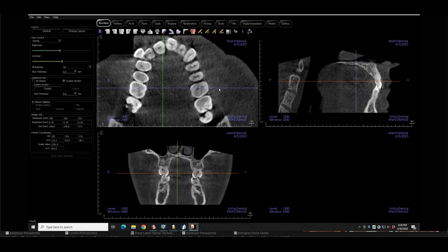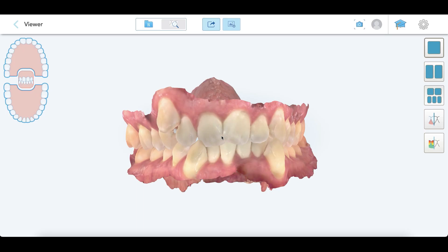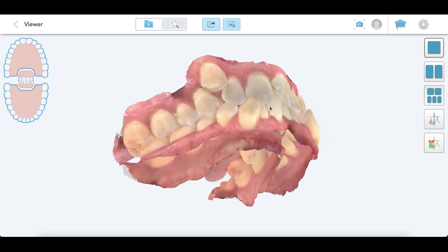I highly recommend that book Breath by James Nestor. You can also see the lower teeth and how far tilted they are, so we're going to use Invisalign on the lower to upright those. We'll have lower trays while we're doing upper expansion, so we'll be working on the crowding on the lower while we're expanding on the upper.